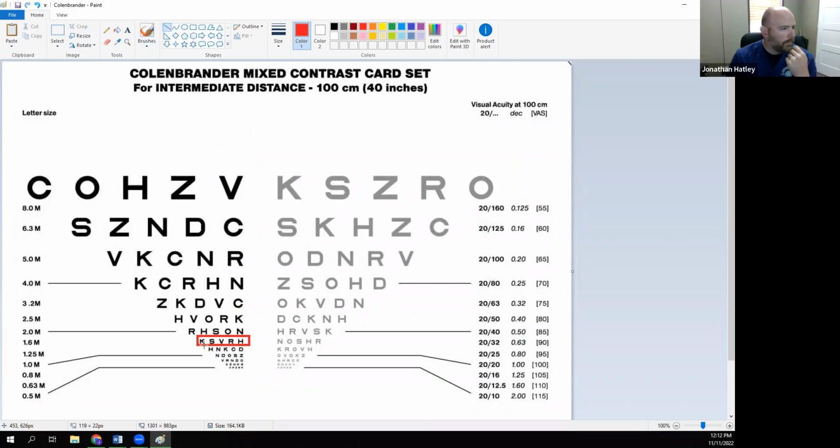and one more line, so they weren't able to see anything here, but they were able to pick up this additional H, then you could say whatever test distance it was conducted at, let's just say 35 centimeters. So in this case, you could write the acuity as 0.35 over 1.6 m plus 1. And so that would be an appropriate visual acuity that they could record in Revolution.